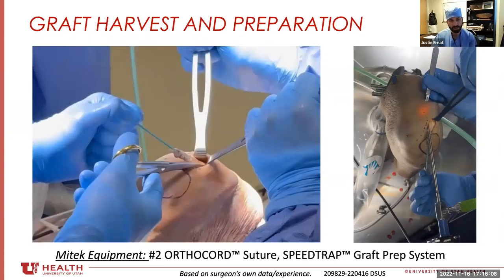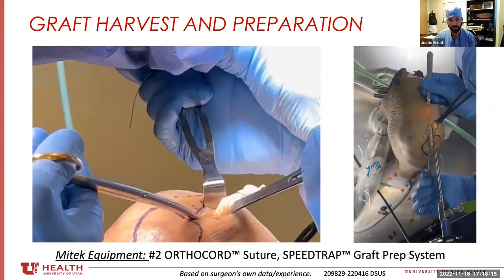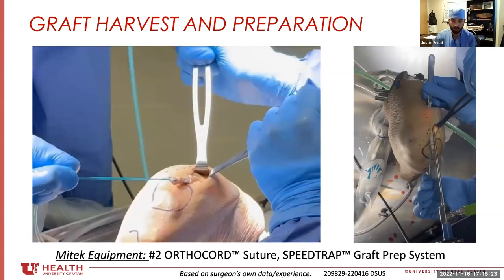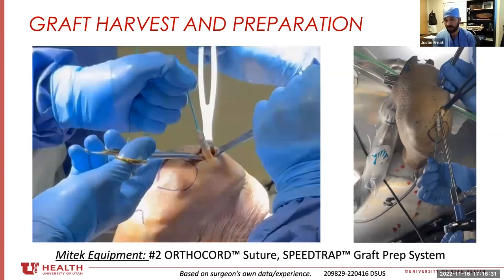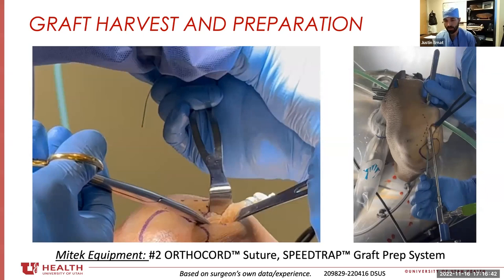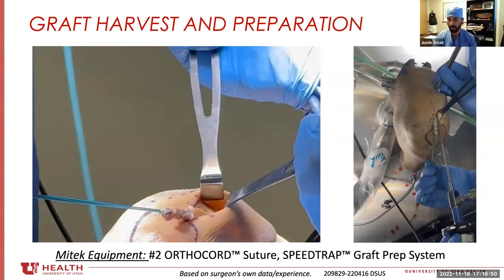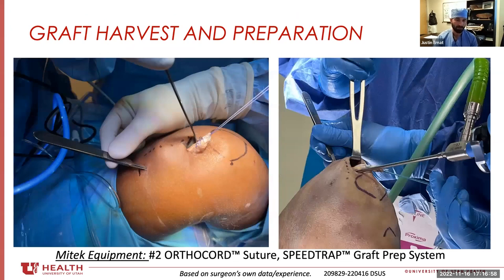With more control gained, it's just continued releasing of the tissue, making sure not to violate the muscle belly — going on the medial side, the lateral side, the undersurface, and keeping sure I don't thin out the graft or cut it short or diverge into the muscle belly. Once I feel I have enough length, the camera can go back in to confirm we're at our terminal spot, or you can just lift the skin and directly look up the knee. Once satisfied, I make a little percutaneous stab incision right at the most proximal extent and release the graft.